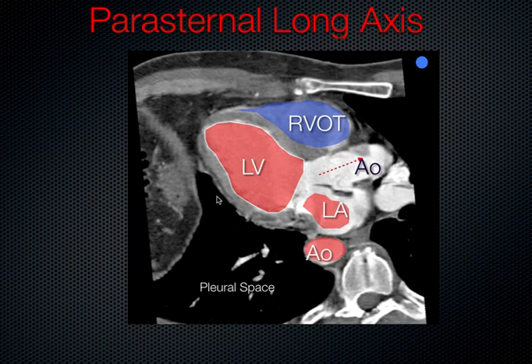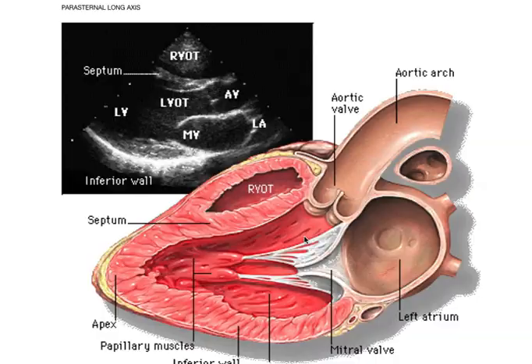And it's right up against the pleural space. In fact, the pericardium is what surrounds the heart, and the pericardium and the pleura are right up against each other right here. That reflection is coming along right here. And this is what it looks like, just another schematic of this.